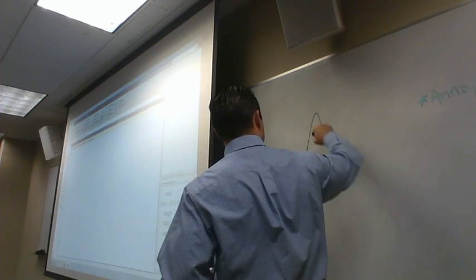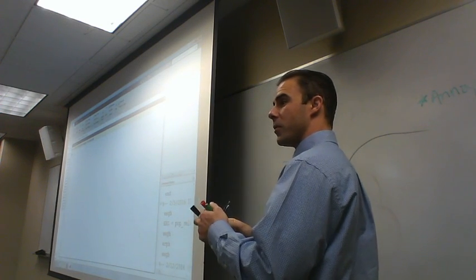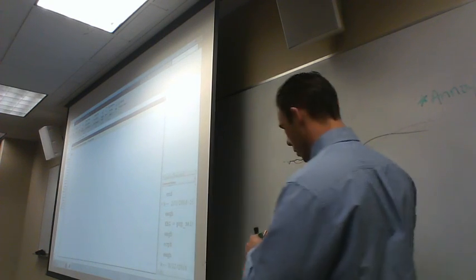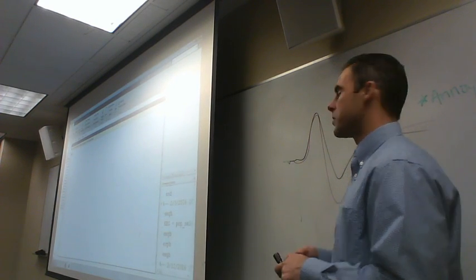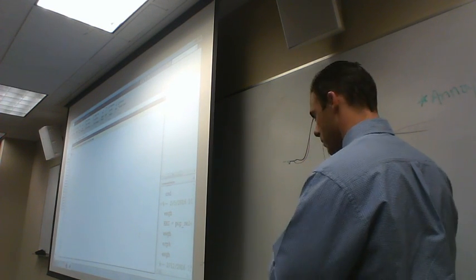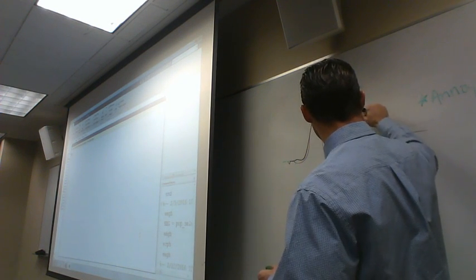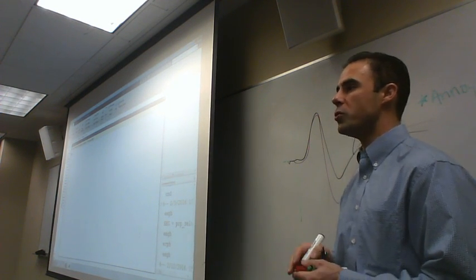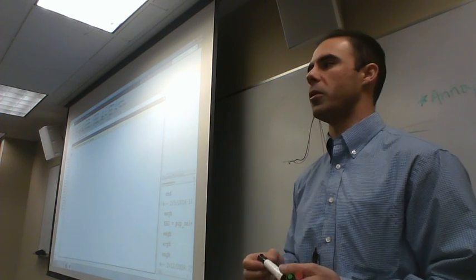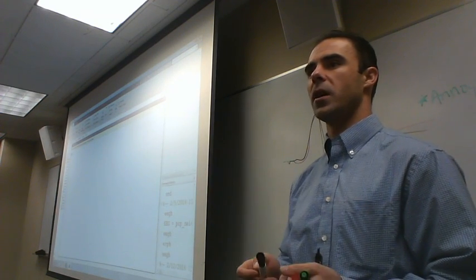So we have our ERPs, right? Now you have a question, and you wanted to create a difference wave between these two ERPs. Let's say that this is the ERP for new items in a memory test, and this is the ERP for old items in a memory test. What is the text file you would use to create that difference wave? Yeah, bin operations is the idea for that.